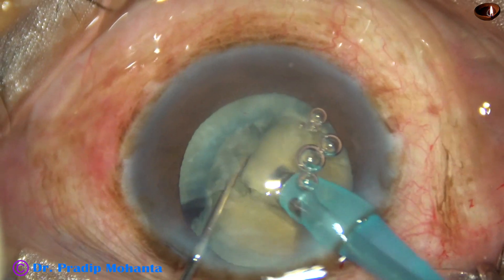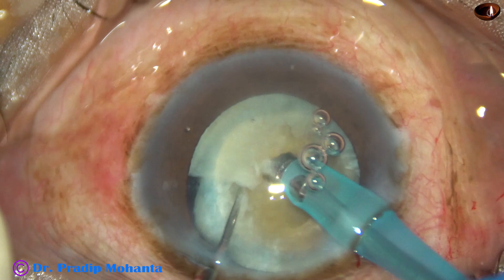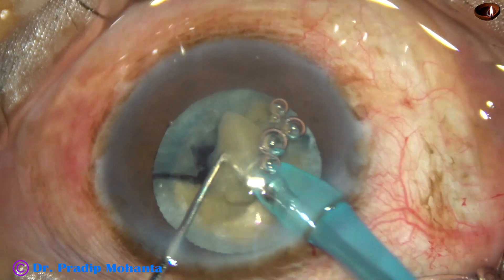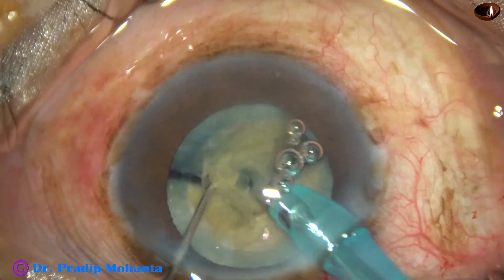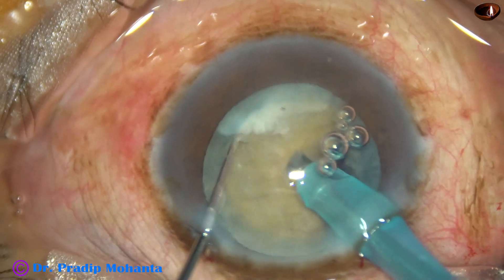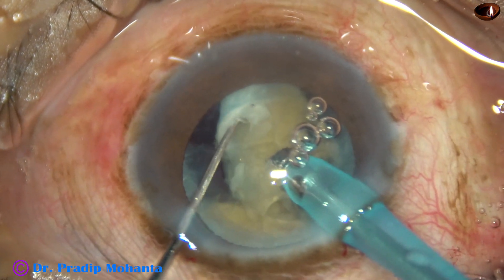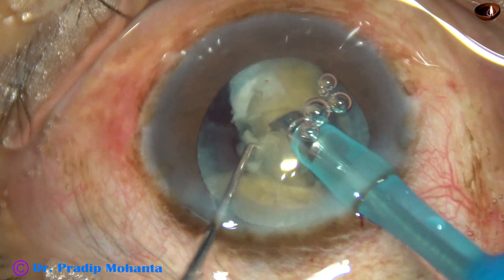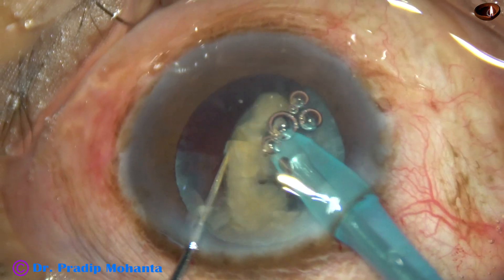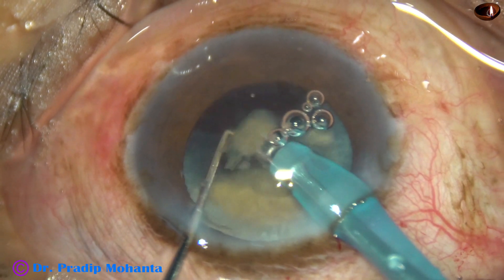Again it is divided in the same way. The heminucleus is chopped at another place. Though the nucleus is quite hard, it is quite brittle, so it is getting chopped very easily. There are no leathery fibers. So these cases are not difficult to chop and not difficult to emulsify. The sclerotic nucleus — we can say grade four nuclear sclerosis — can still be emulsified very nicely.